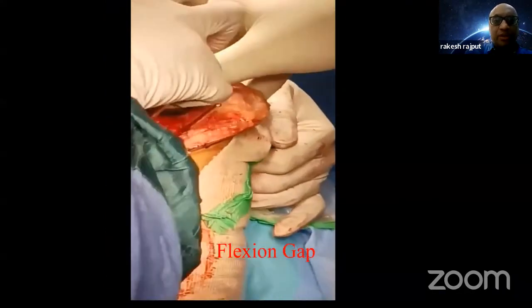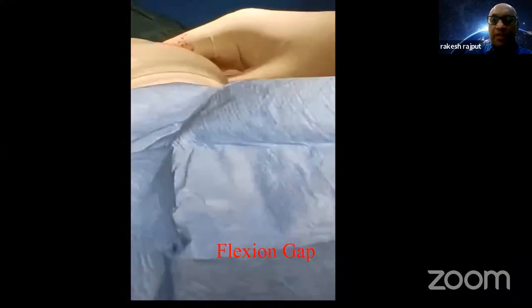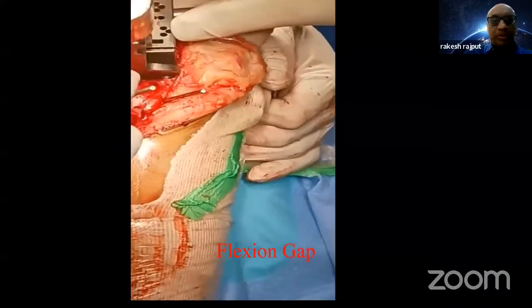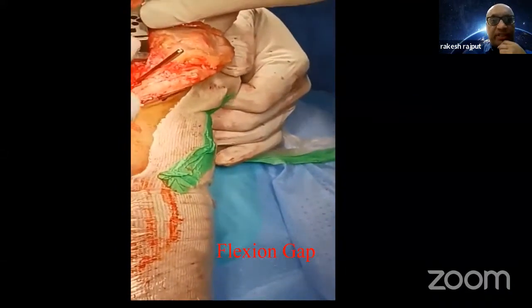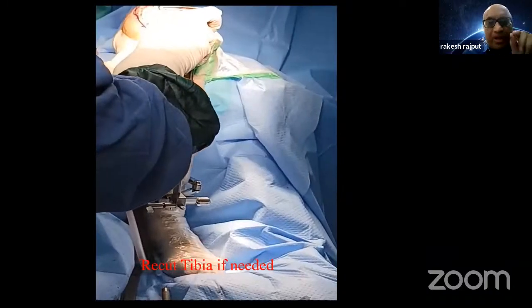Once you've done that, you now want to look at the flexion gap. So this is the first thing you're going to create, a flexion gap. So it's called the flexion first technique. This is the spacer which you put in. You're just seeing the spacer going in. You should not be hammering too much. The moment you have to hammer it a bit too much, it's tight. So come back and recut the tibia.